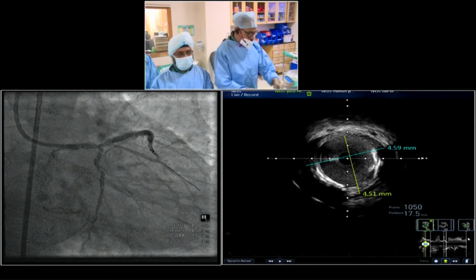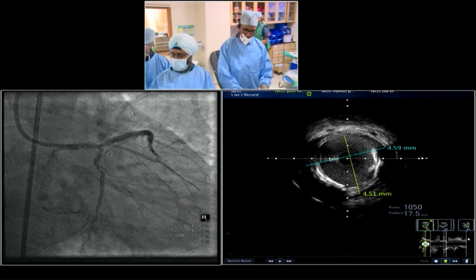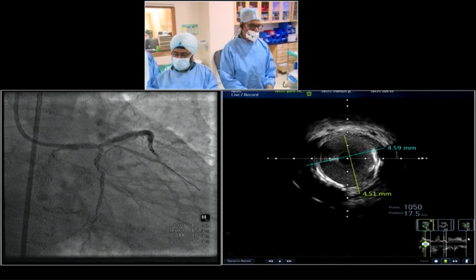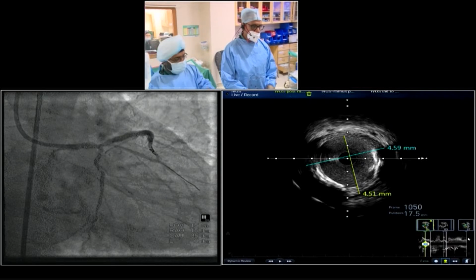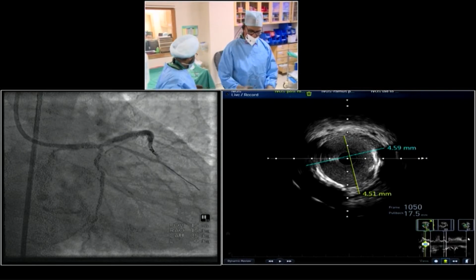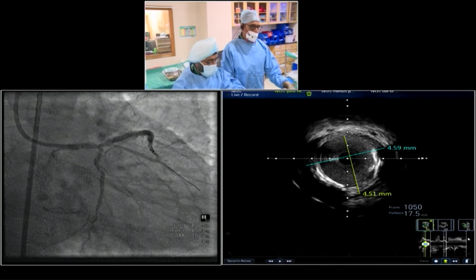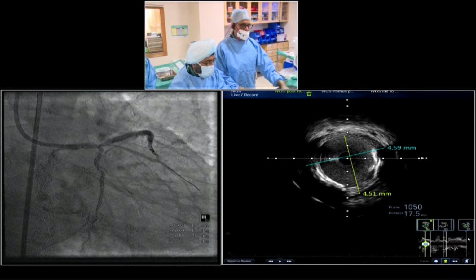I leave it to Dr. Shri Kumar for questions, answers and your valuable comments on this summary. Thank you, Doctor. You have made the mid-LAD look better. Now I think you are trying to cover the ostial LAD and distal left main with a crossover stent. LCX ostium looks free from disease. Hopefully we shouldn't have any trouble there, but you are still protecting LCX with the wire. Bed preparation is already done, and the distal left main and ostial LAD are dilated with a balloon.